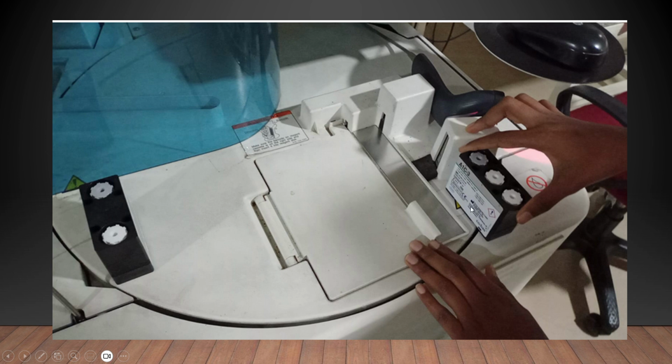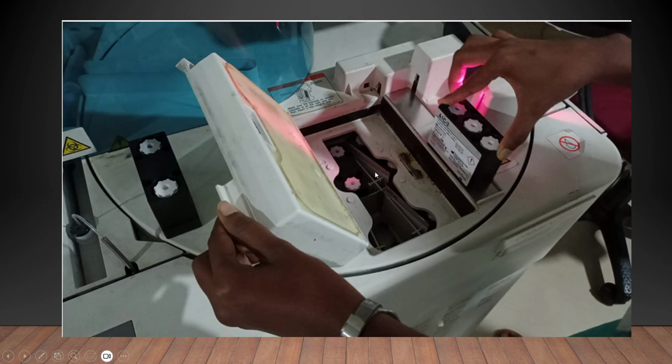Okay, now if you want to add any more reagent, you just keep quiet. After the movement, the reagent disk will move, and it will again open, and again you open this door, and again move the reagent barcode into it.